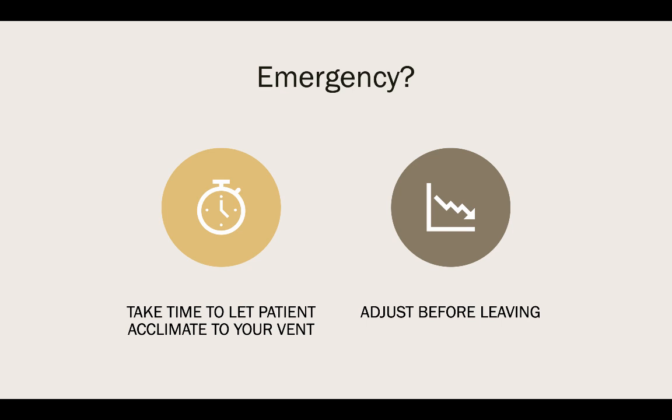Give them 10, 15, 20 minutes to acclimate to your vent before you go anywhere, because they might need some adjustment, and you want to adjust that before leaving because you've got a respiratory therapist right there. You've got a physician right there. You've got maybe an ICU nurse right there who can help you out a lot. You've got a lot of resources right there next to you. So when choosing what to start your patient on, if you're taking them from the hospital on an interfacility transport, just copy what the hospital's doing. Give them a few minutes to acclimate to your vent, to your machine, and then if something is going a little wonky, adjust it and use the resources you have there with you.